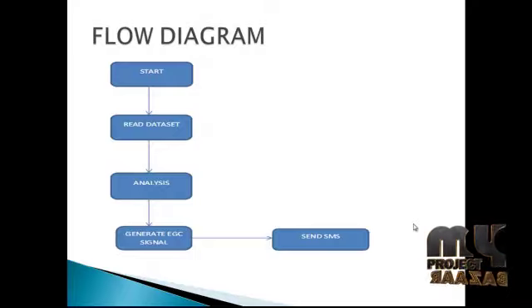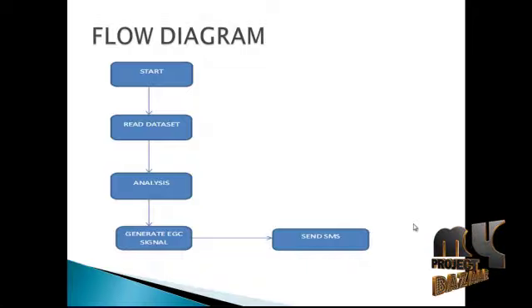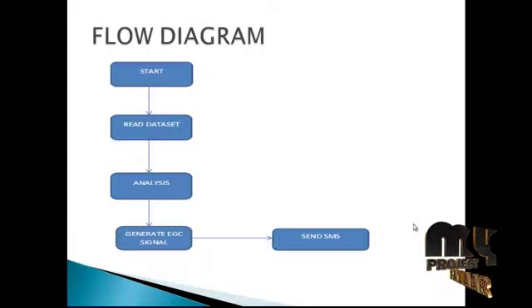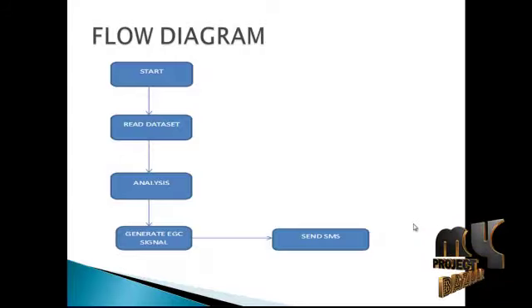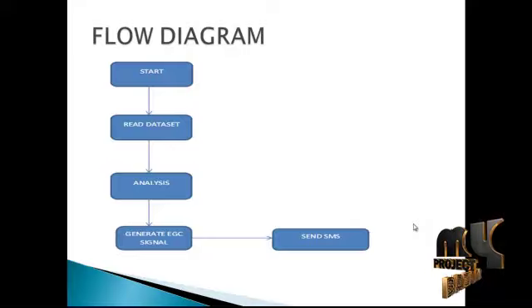After analyzing the data that it displays on the screen, the ECG packet will be decoded and plotted using the Java language. Analyze the ECG wave. We will analyze the ECG wave by counting the spikes in each cycle of the ECG wave. The highest spike value is calculated and compared with the threshold value. If it is not within the threshold, then an alert is generated.